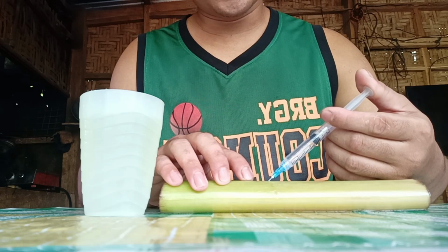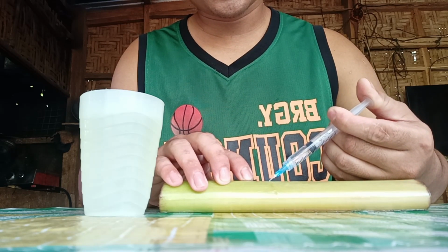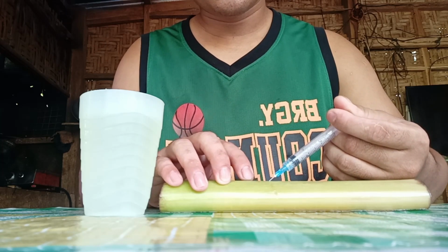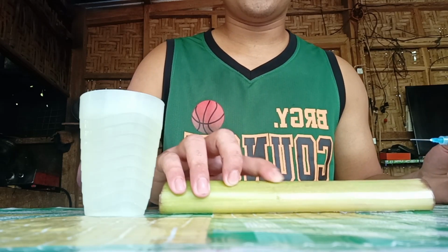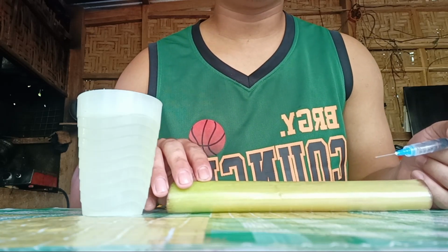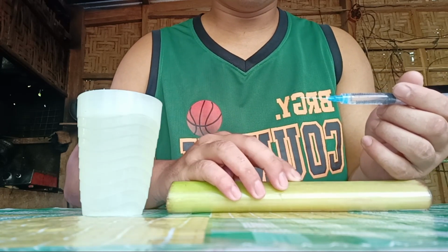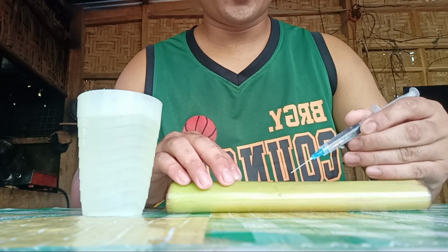Then inject the medicine. Massage after injecting. Injecting subcutaneous injection would be a 45 degree angle. So massage first before injecting, and then inject it at a 45 degree angle.